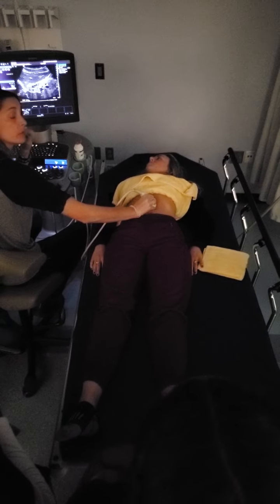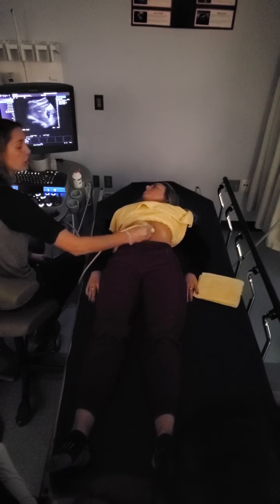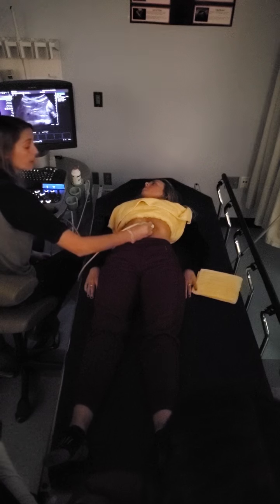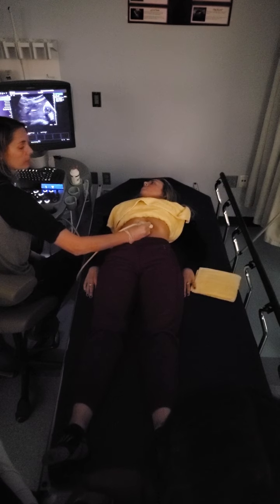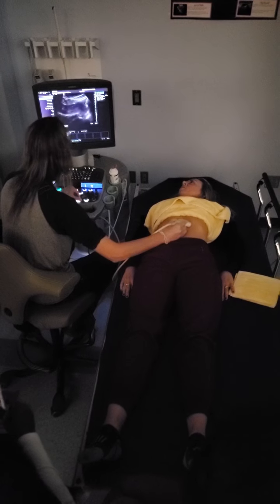Okay, annotation time. What am I annotating? Transverse. You got it. Now this becomes a little bit trickier because your probe's going to want to slide along that rib cage and end up more in sag. So you want to make sure that you're not too sagittal, but you can have a little bit of angle to your transverse. So go ahead and big breath in and hold it.